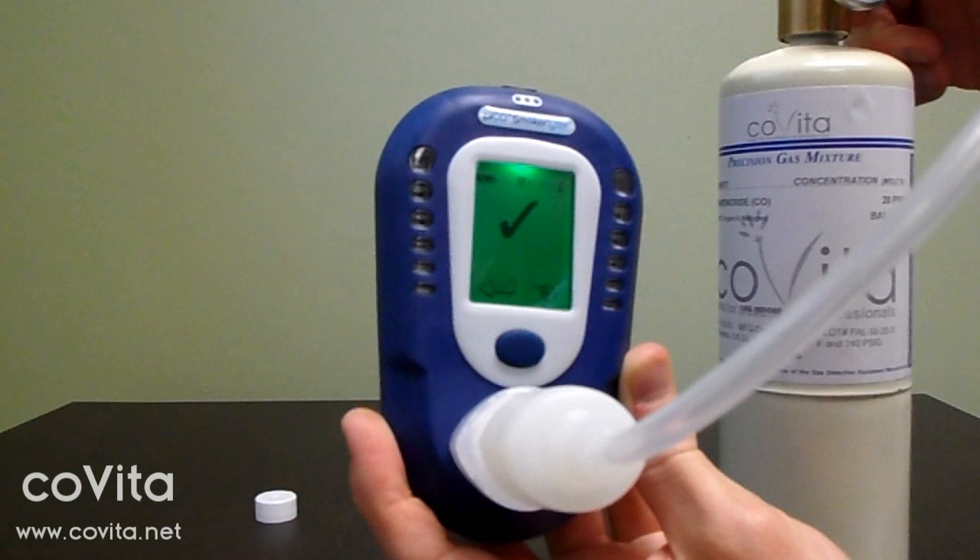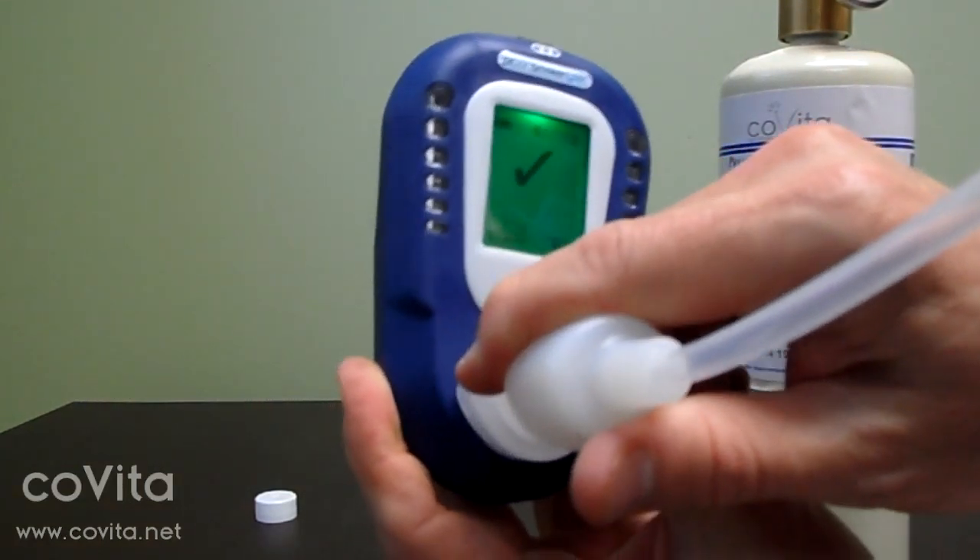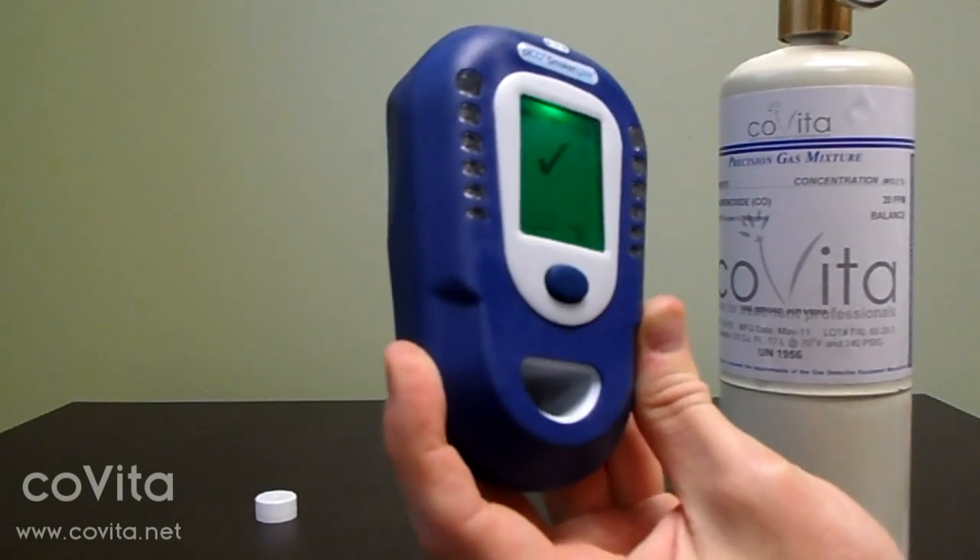If you continually receive an X, call Covita for technical support. Next, remove the D piece. Double click to respond to the check mark.